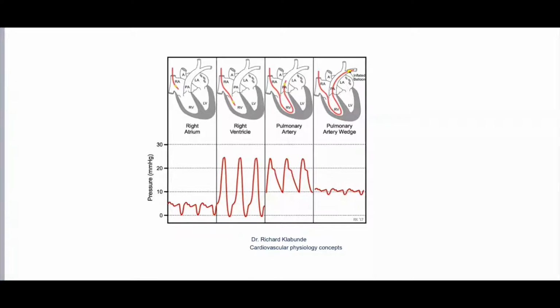How do you know you are wedging? If I have the tracing of the pulmonary artery, the dicrotic notch of the pulmonary artery tracing.